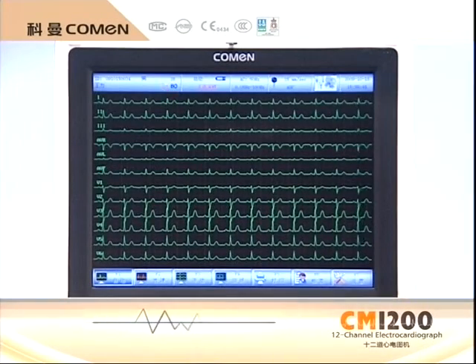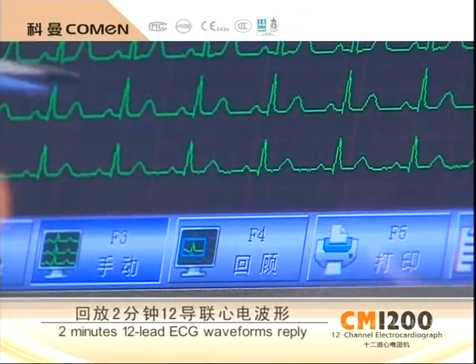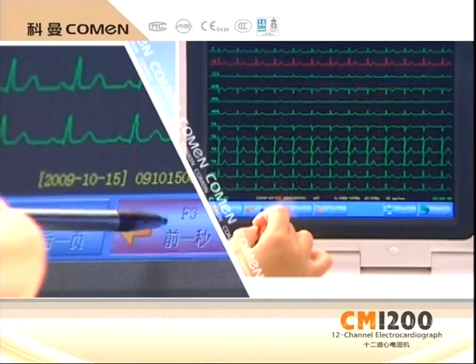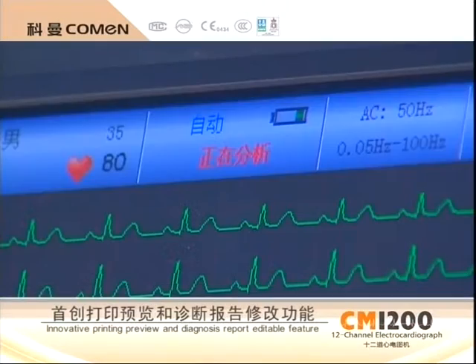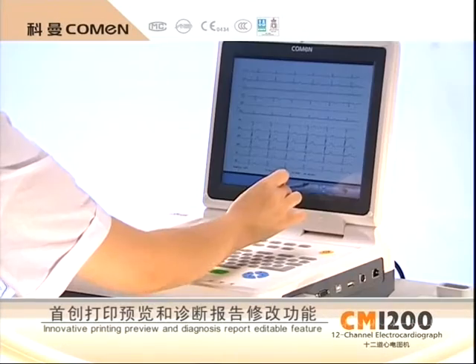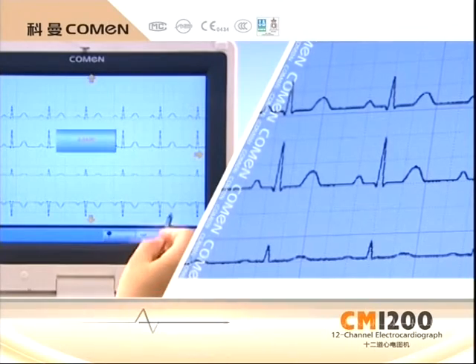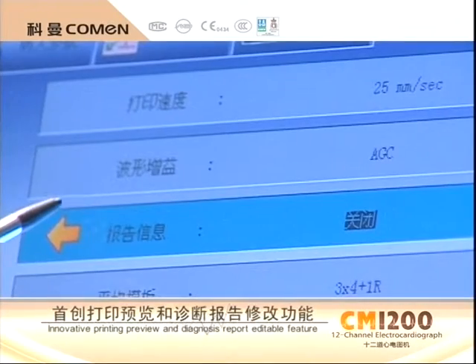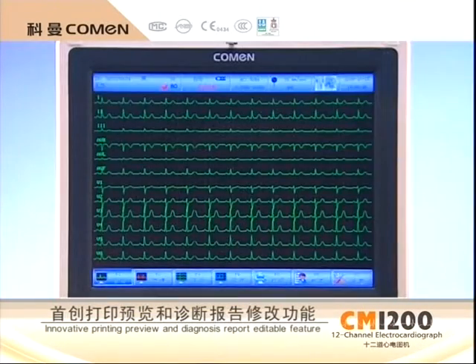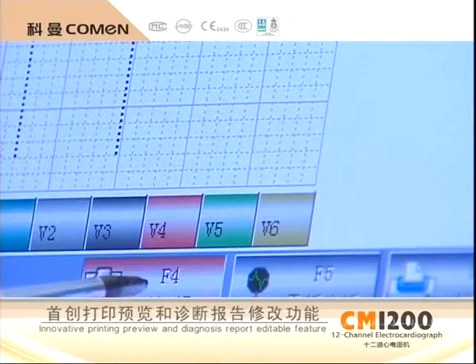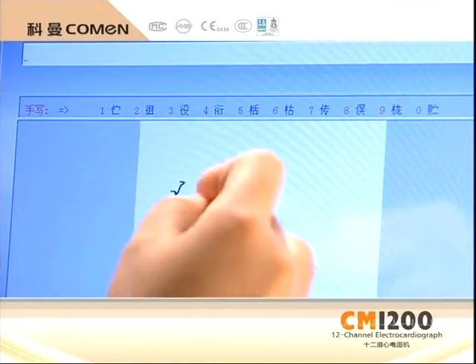Real-time ECG wave freezing and playback function brings more convenient viewing. The printing preview function helps with careful viewing of ECG and analytical results. The diagnostic report revising function enables you to directly issue a diagnostic report with the CM1200.